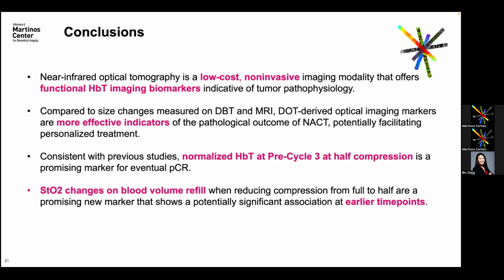Yeah, it's definitely not isotropic. Breast tissue has glands and ducts, connective tissue fibers and fats, so they have different responses to the compression. We actually have a paper studying the relationship between the compression and the hemodynamic changes, and we used finite element modeling to simulate the compression in breast. So you have to make some assumptions.